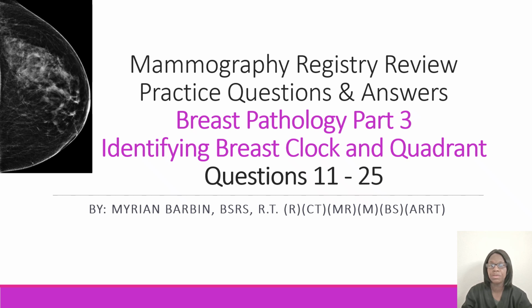Today's video, we will be identifying different cases, breast clock positions, and breast quadrants. And I have several review questions and answers for you.